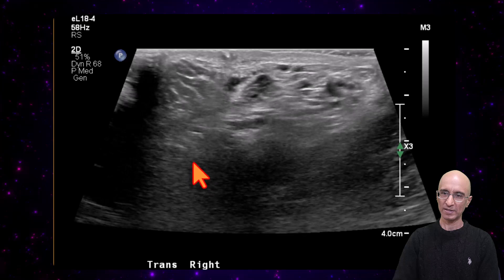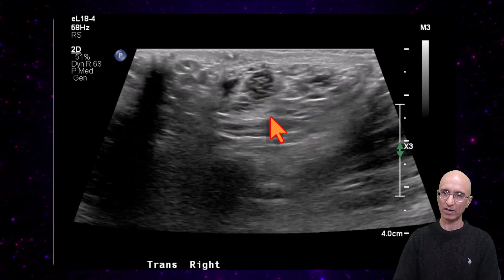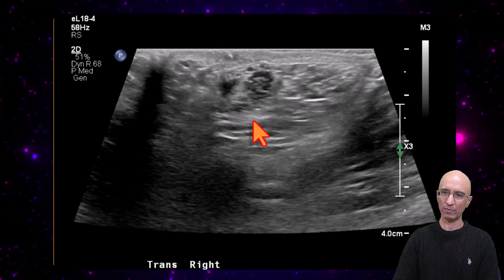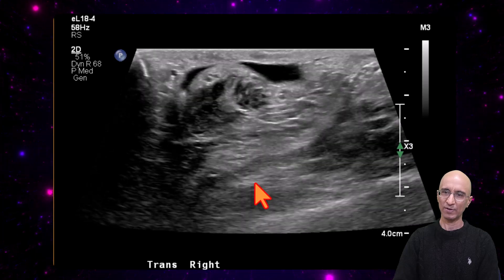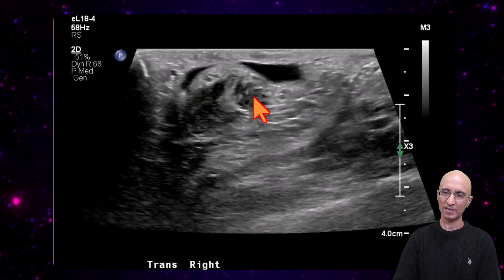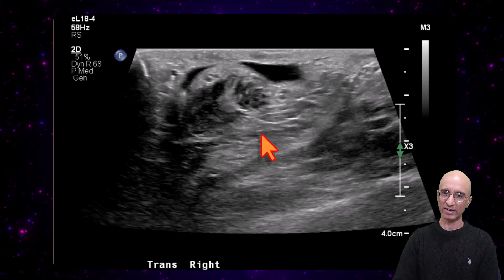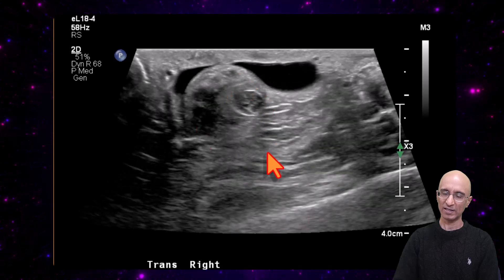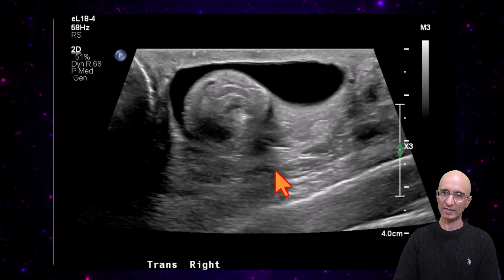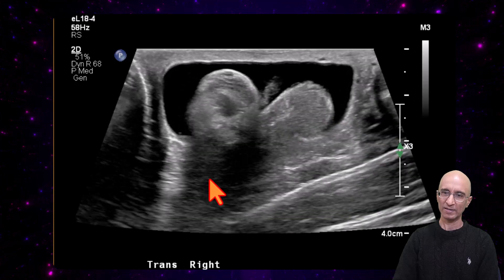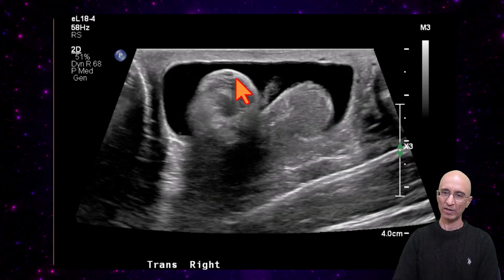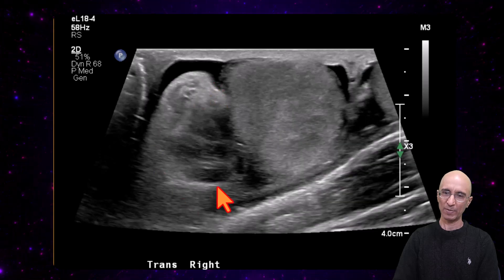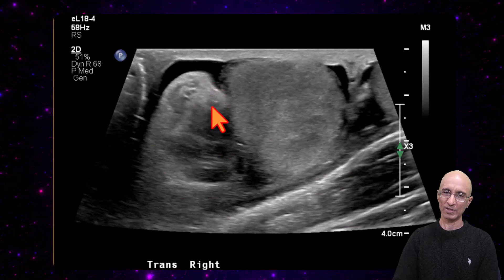I'm going to scroll through the series of images. This is the normal spermatic cord containing both the testicular artery and the pampiniform venous plexus. As I scroll down inferiorly, we can see the spermatic cord is increasing in size, and as we follow the internal structures of the spermatic cord, we can see swirling of its contents, which appears like a soft tissue mass lateral to the testicle.